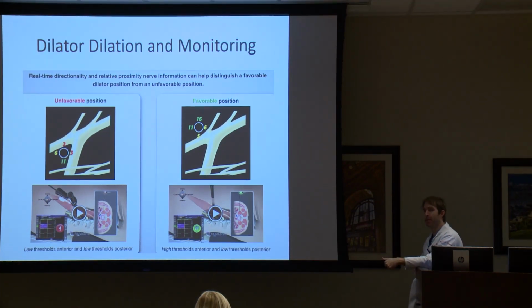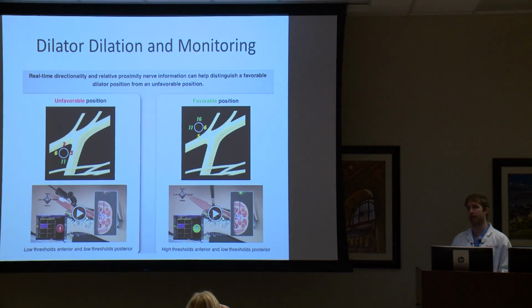K2M is a nice system that I know that Dr. Kinsman and Dr. Reichen used to use. Dr. Kimmel's finding which system he would like. I'm sure Anessa could tell you that better. I know he's tried Globus, and then I use Medtronic just because the rep is really good. They have a good system. It could tie in with doing things with nav, and also they've got a nice posterior system. And again, I typically do things lateral and posterior at the same time.